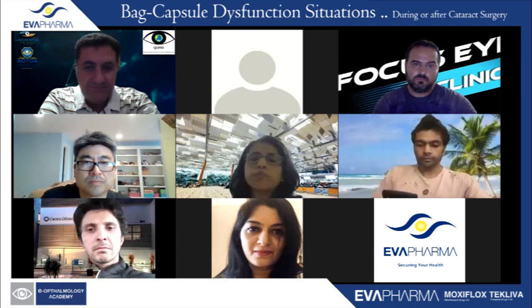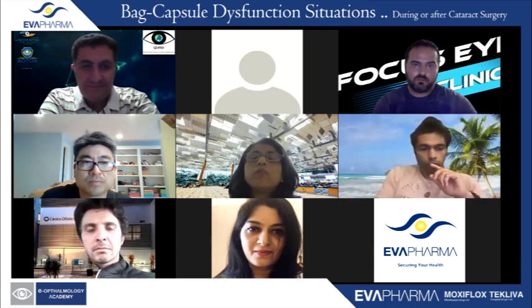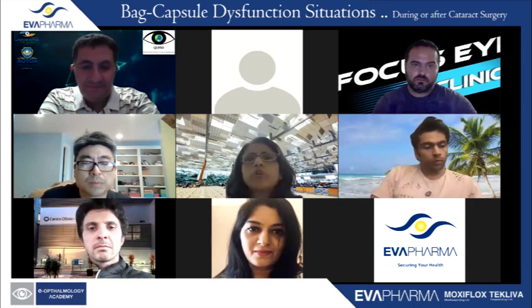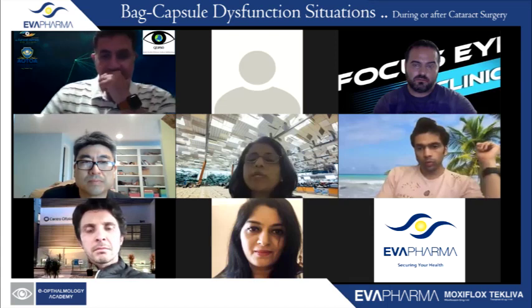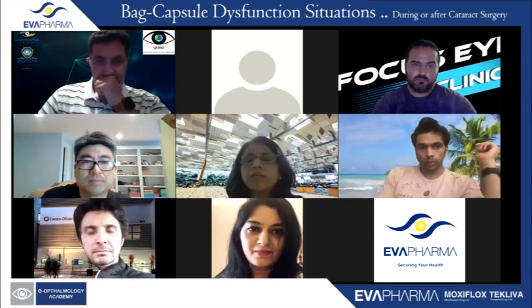It's very controllable. And you do it at 9 and 3 o'clock, right? It would depend. If you're having a very large eye, you could go vertical. Otherwise, normally our standard technique is generally 3 and 9.